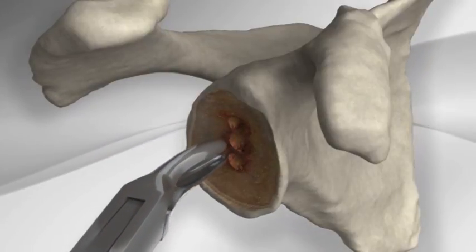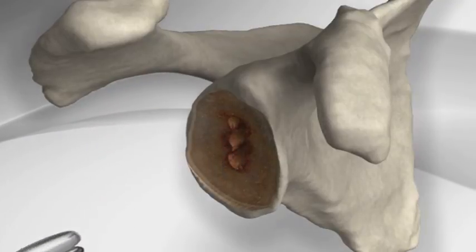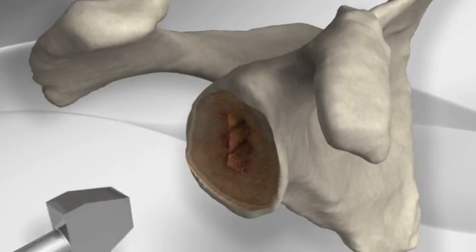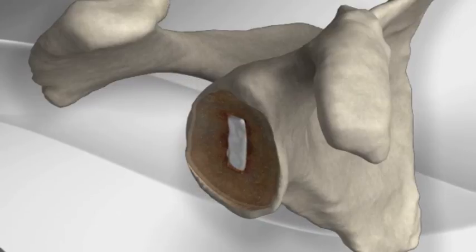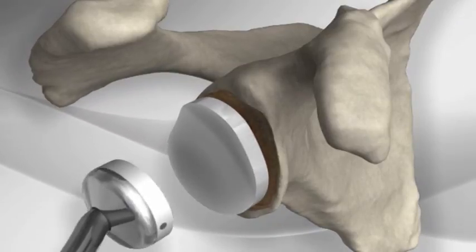The bone between the holes is removed and a punch is inserted to convert the hole into the shape of a triangle. Cement is placed in the hole of the glenoid and on the back of the prosthesis, and the new glenoid joint surface is cemented into position.